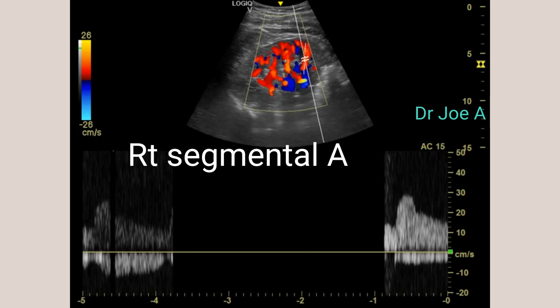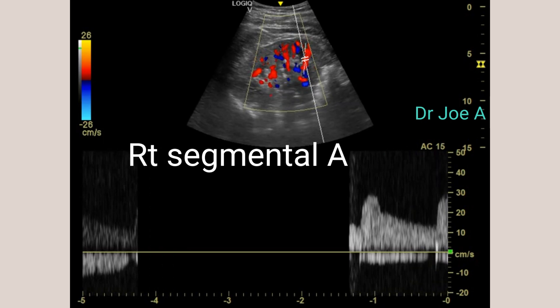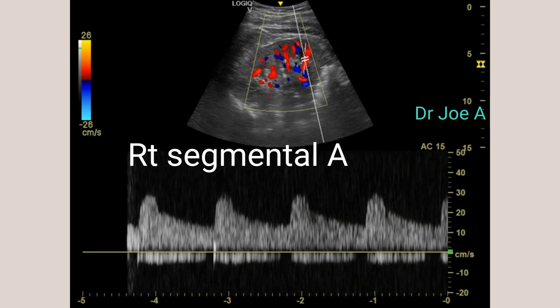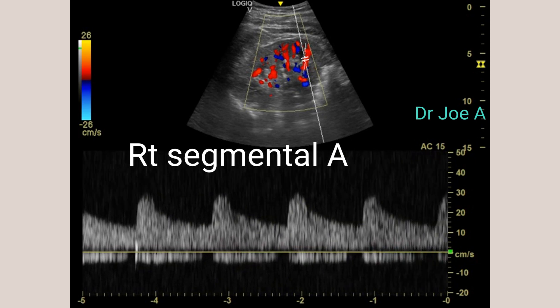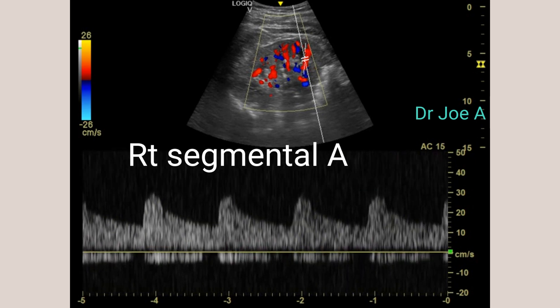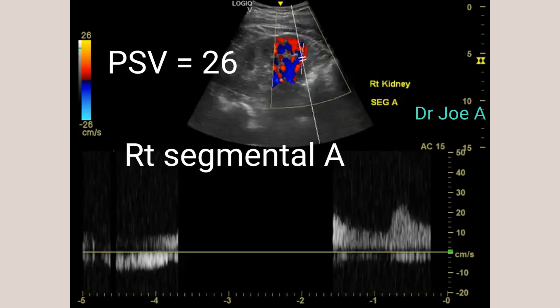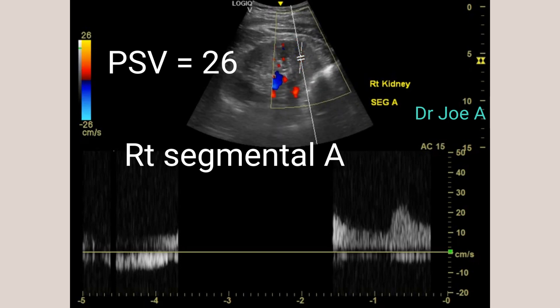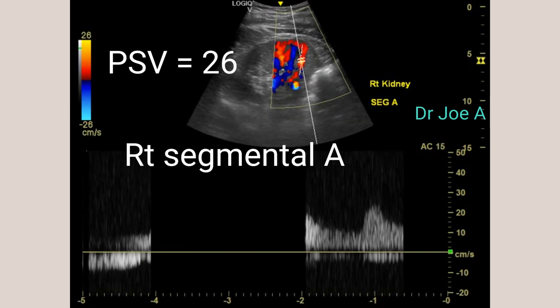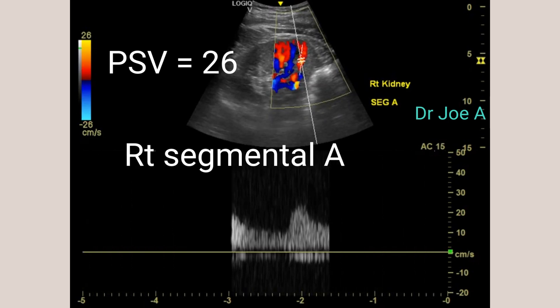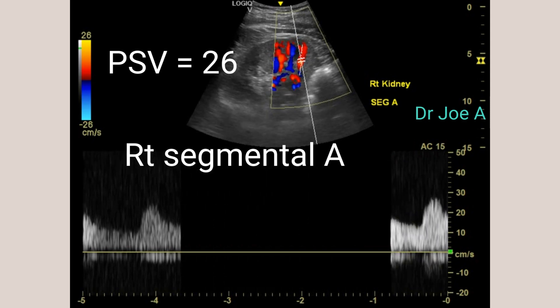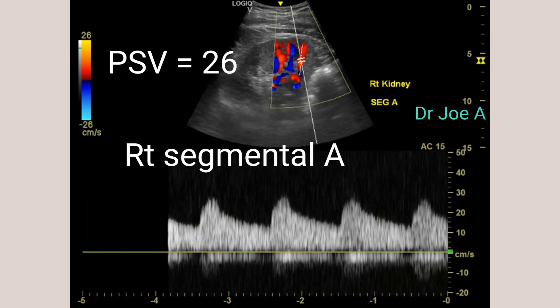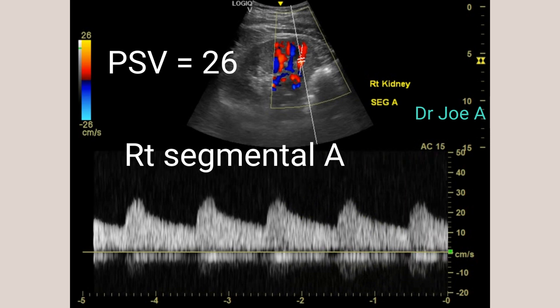The peak systolic velocity in the segmental arteries is slightly lower than that in the renal arteries. The peak systolic velocity in both segmental arteries appears to be in the range of 26 to 30 cm per second, with an RI of around 0.45. These values are totally normal.